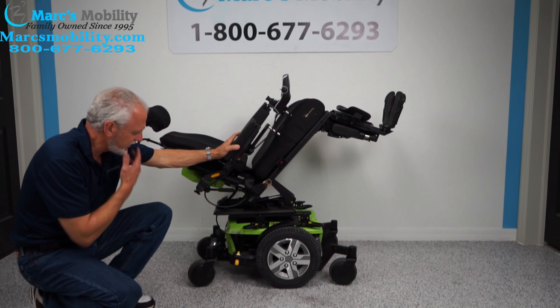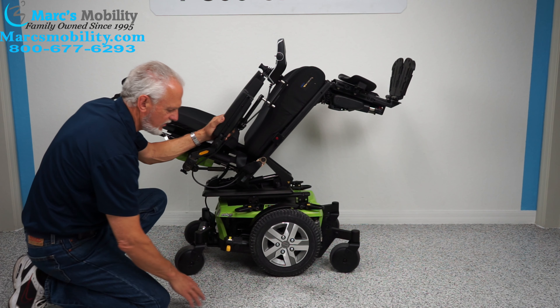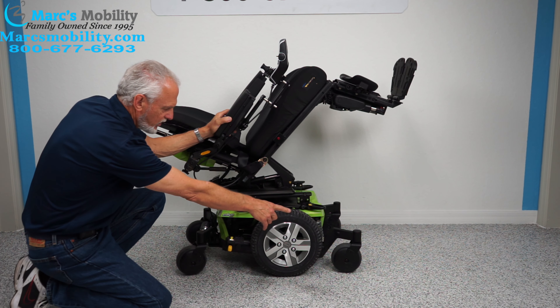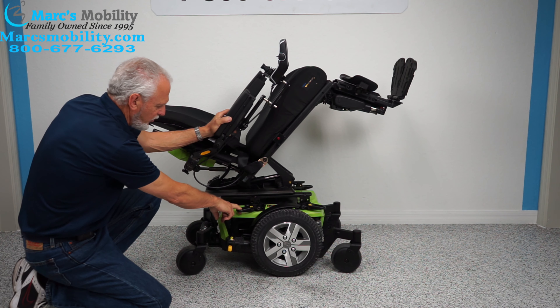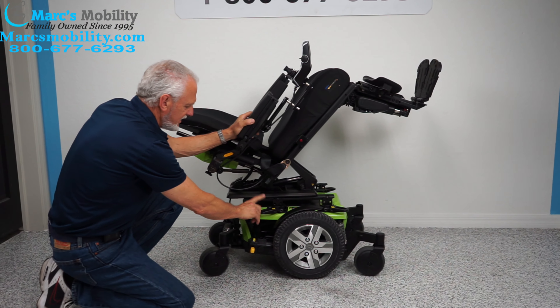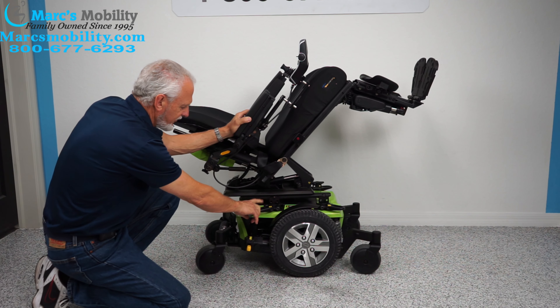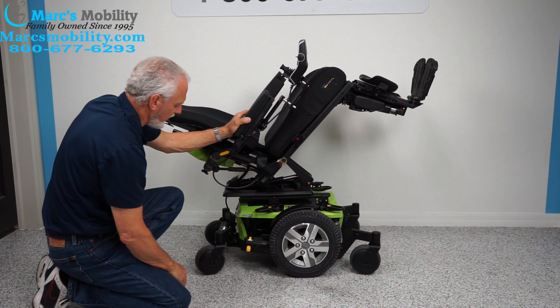Let's look at the base while we have it tilted. You have 14-inch wheels, solid tires — they do not mark your floor. You have caster wheels in the front and the back. You have these anchor points; they're screwed right to the frame, they're not going anywhere. This is where you secure your chair to your lift for transportation, into your van or your lift — right here and right here. There are two here and two more on the opposite side, so you have four anchor points.